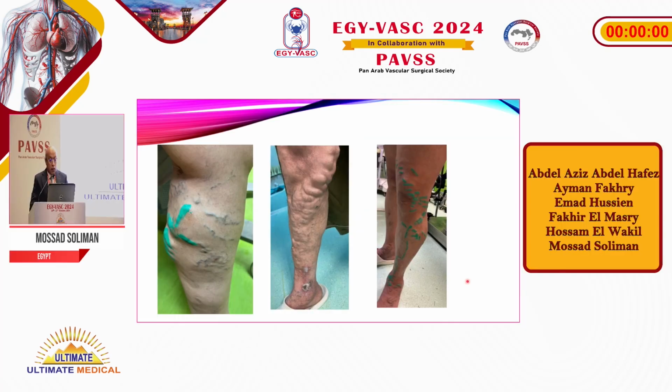Let's go through this kind of varicoses, like truncal and extratruncular varicoses, in the course of radiofrequency ablation, and how much it affects the patient's health and daily life.